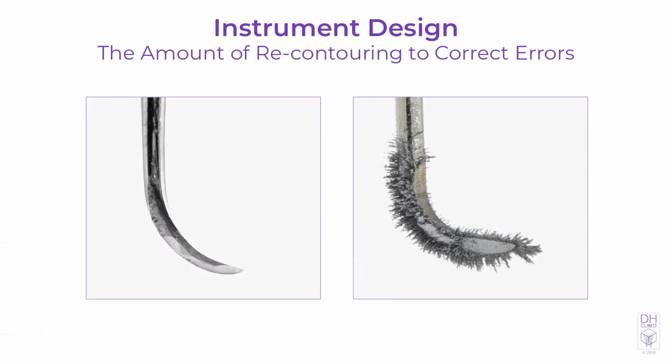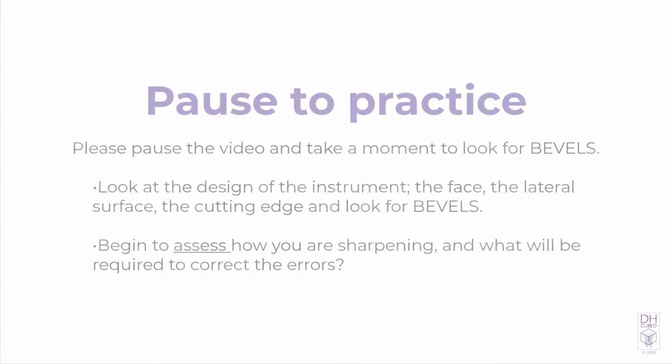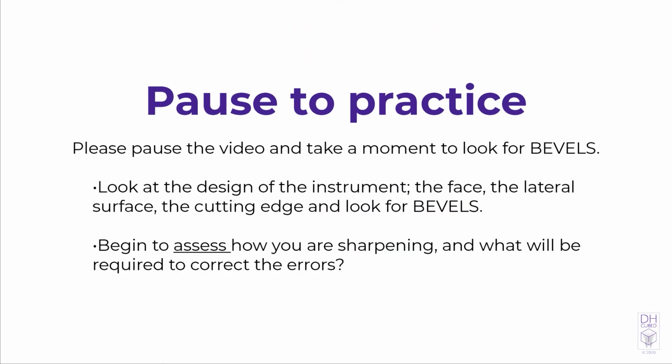In order to remove the bevels, the instrument requires recontouring to get it back to its original shape and design. As a consequence, a lot of metal must be removed, and it will take much longer to get this instrument sharp. Please pause to practice.